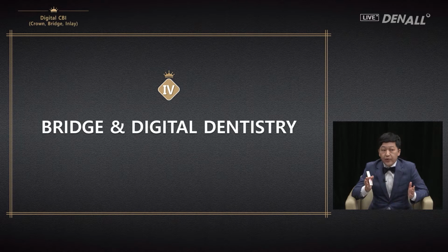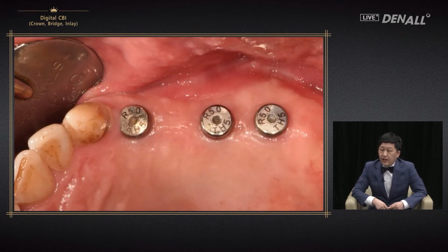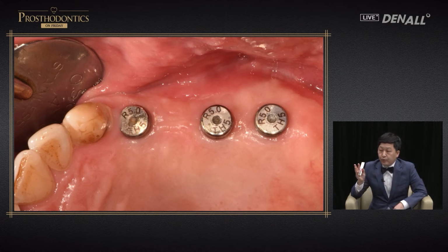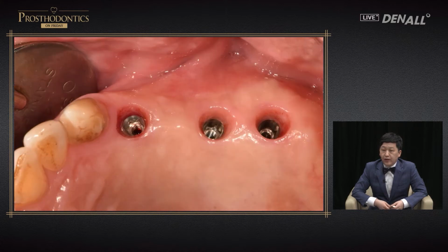Finally, I'd like to talk about making a bridge using digital techniques. Implants have become much more common these days, and cases for bridges have decreased, but implant bridge cases have increased. In number 4, number 6, number 7, implants were placed. In number 5, a pontic was designed.